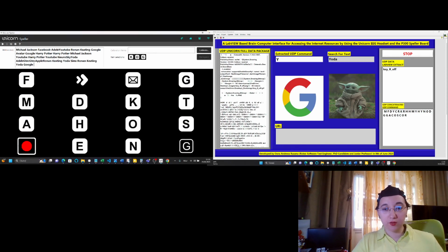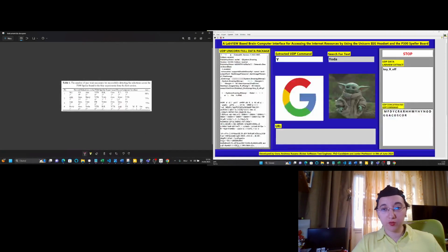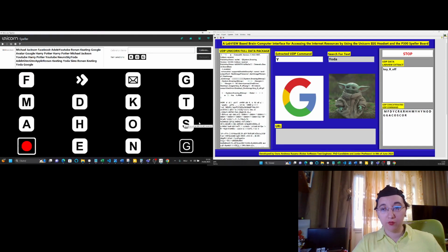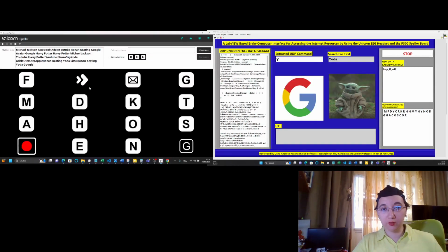Okay, so this task was more challenging than the other ones. Now I want to search for Sims in YouTube. So I'll try to firstly select this character, abbreviated with the S character, and then I will try to select the YouTube related symbol, this one. So S is the first one and YouTube is the second one.